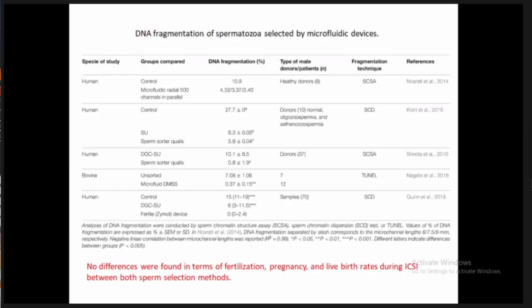And with respect to microfluidics, various studies have compared microfluidics with conventional sperm preparation methods. Again, they found there are no significant differences in terms of fertilization, pregnancy, and live birth during ICSI between both the methods, advanced as well as conventional sperm preparation methods.